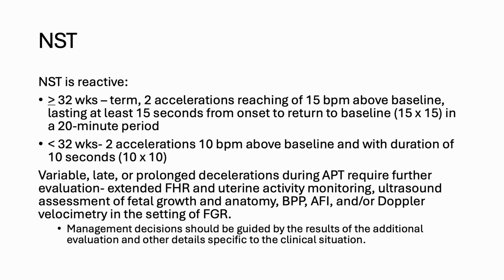If they're less than 32 weeks, we say 2 accelerations with a 10 beat per minute increase above baseline with a duration of 10 seconds. So a 10 by 10. Of course, you would need to know the baseline to be able to determine this.